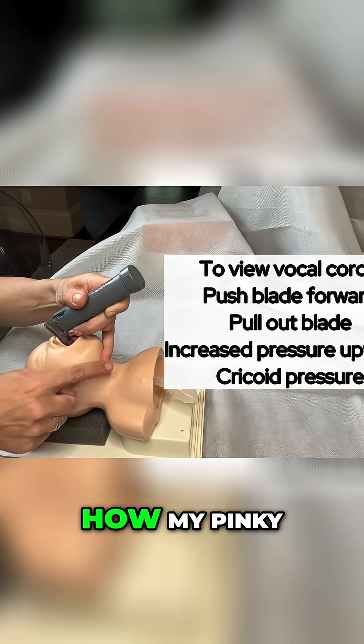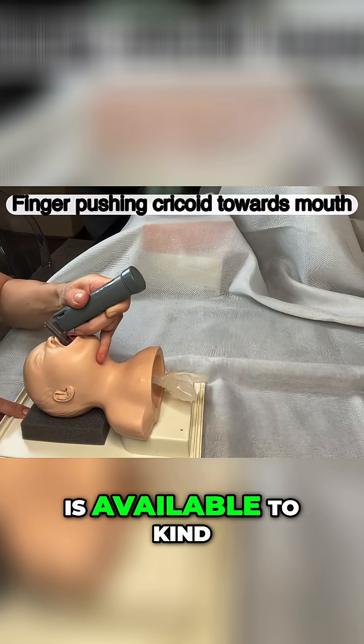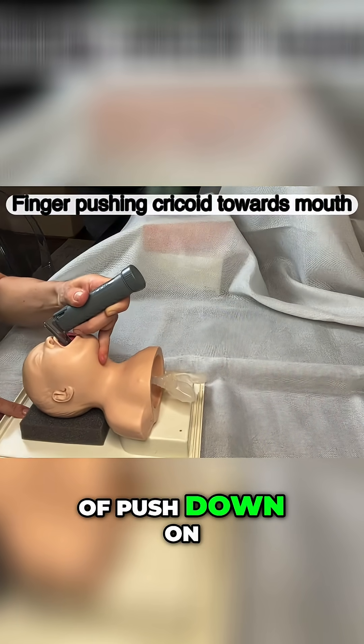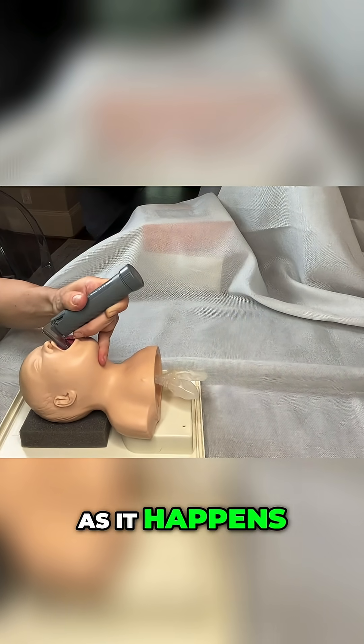If I still can't see anything, I'll try to use cricoid pressure. You can see how my pinky — my baby finger — is available to push down on the cricoid, hoping that will help the cords drop into view.